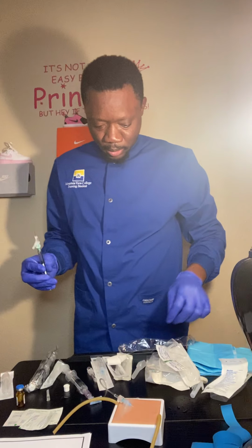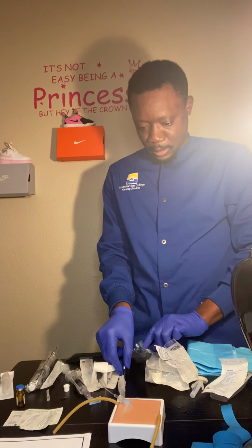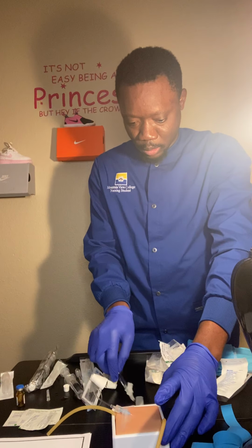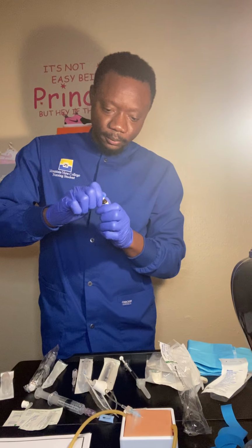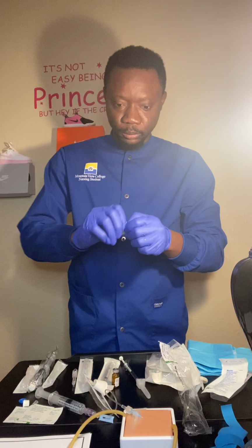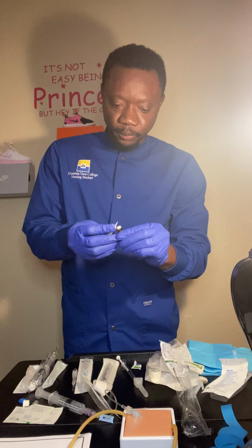Okay, so I should go ahead and put it back. Okay, because I need to clean my medication, I use alcohol prep to clean my medication. Okay, now I'm ready.